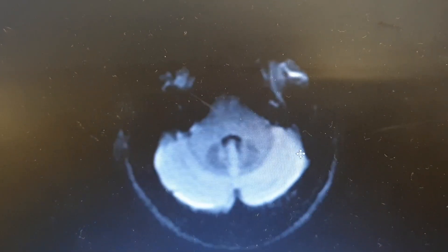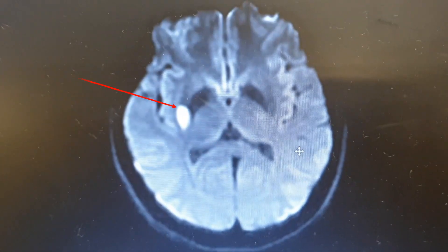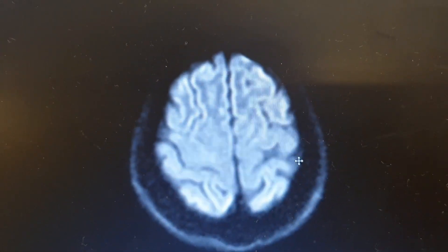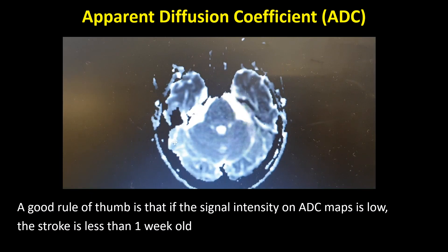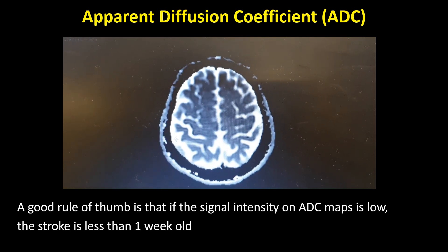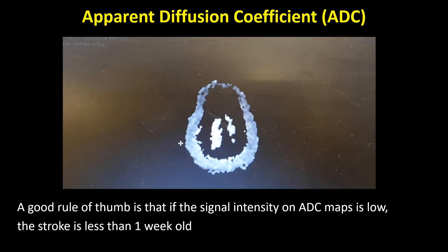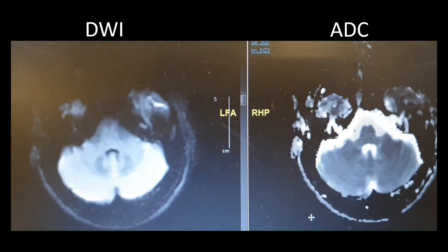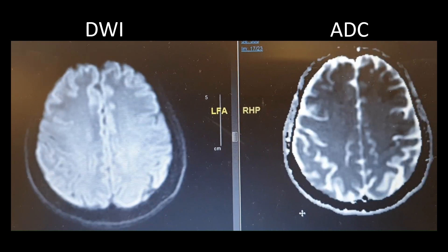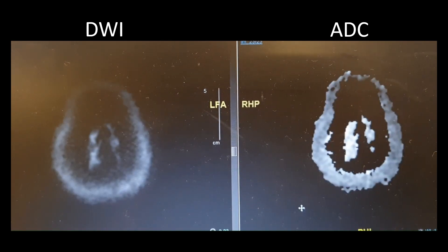This is a patient who presented with an acute onset of left-sided weakness. There is a DWI hyperintensity in the right putamen extending to the right corona radiata. A good rule of thumb is that if the signal intensity on the ADC map is low, the stroke is less than one week old. The DWI is shown side by side with the ADC sequence, demonstrating DWI hyperintensity with corresponding restricted diffusion on ADC map, compatible with an acute infarction over the right putamen extending to the right corona radiata.